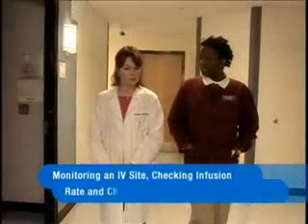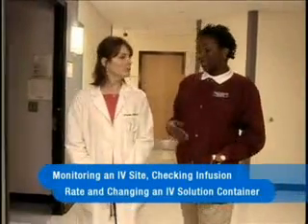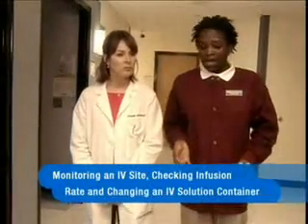Well, my patient is receiving IV fluid since having surgery 4 days ago. He has an IV infusion of 1,000 cc's of normal saline, which is running at 80 cc's per hour. It's about time to assess the site and get the next container of ordered solution ready for administration. Okay, so what's your plan, Tamika? Well, using the MAR, I've already checked the order for the type of IV solution and the rate of infusion. Then I calculated the hourly rate of infusion and the drops per minute.